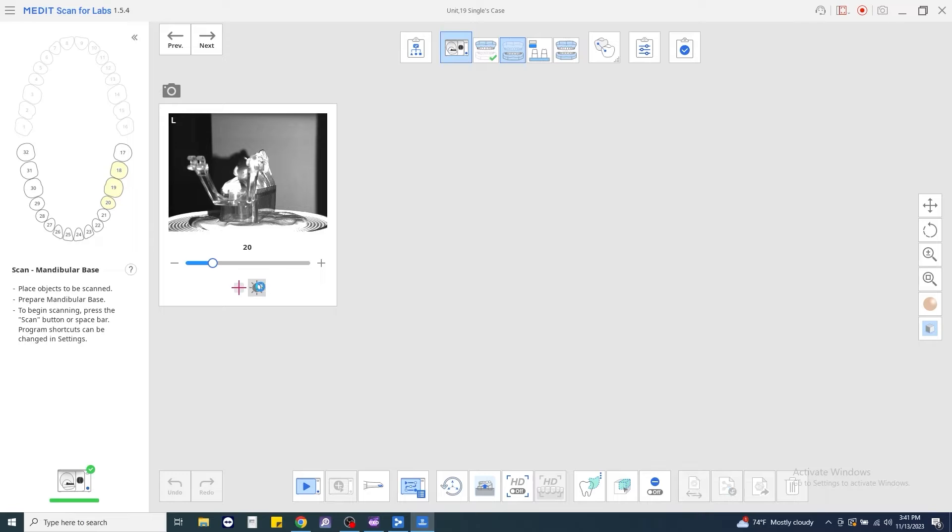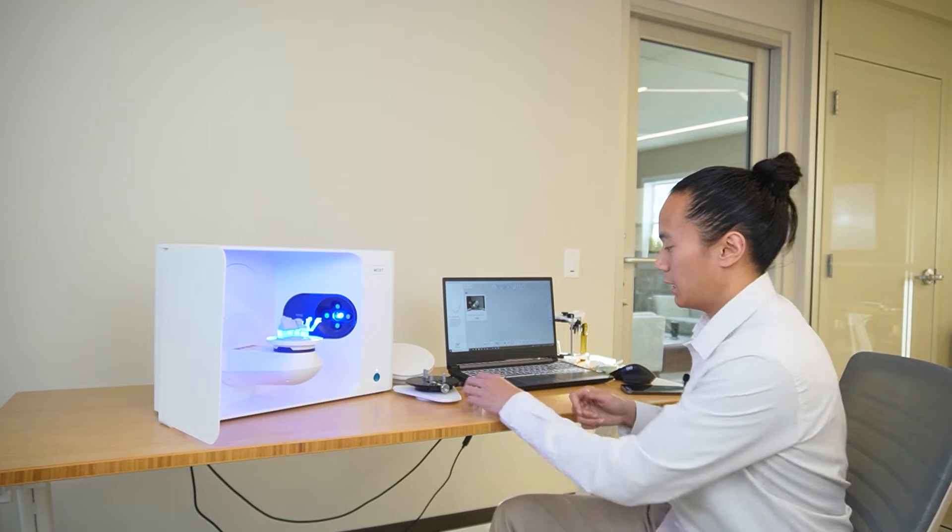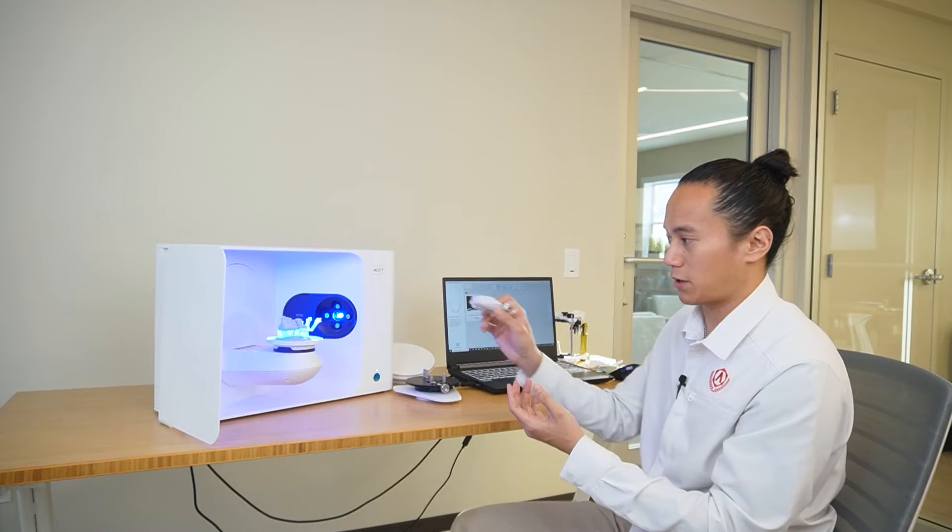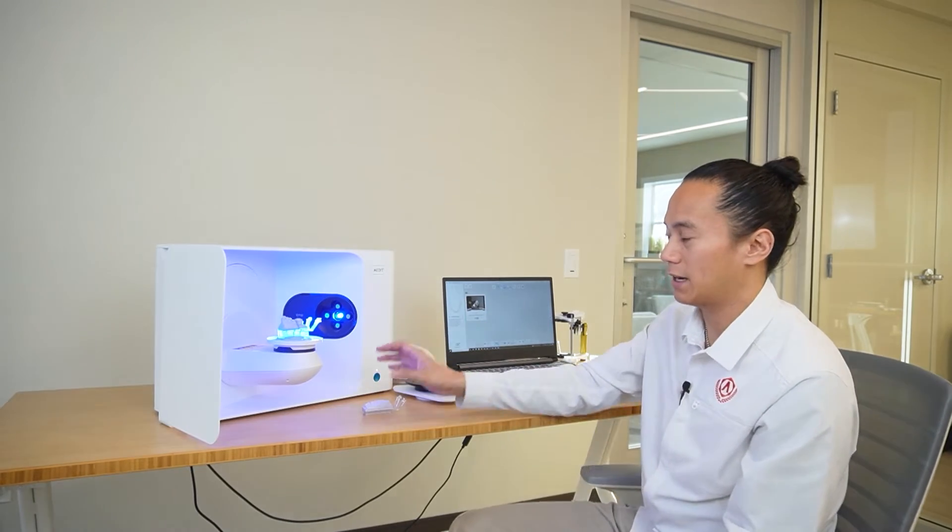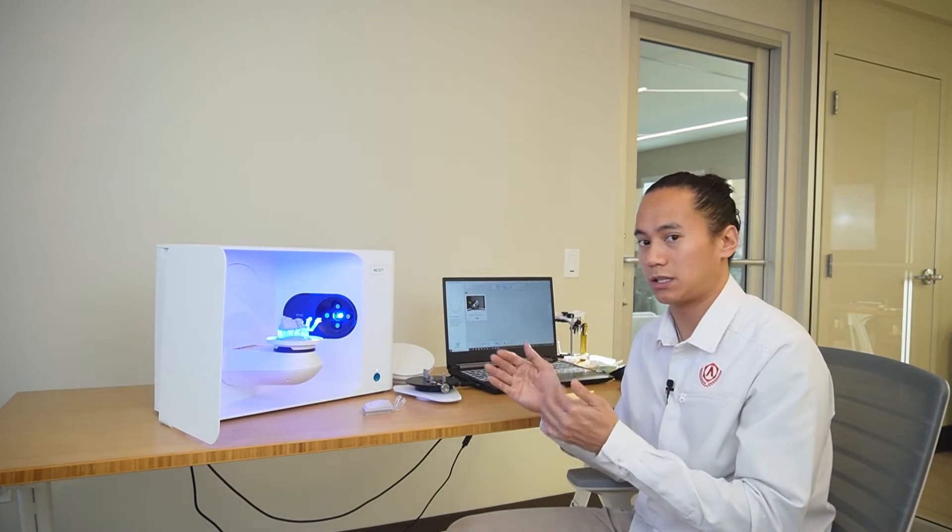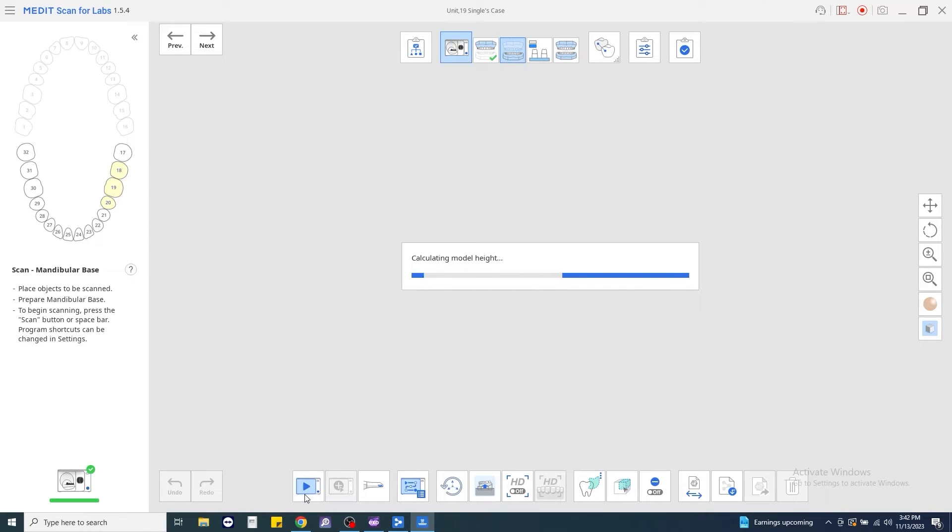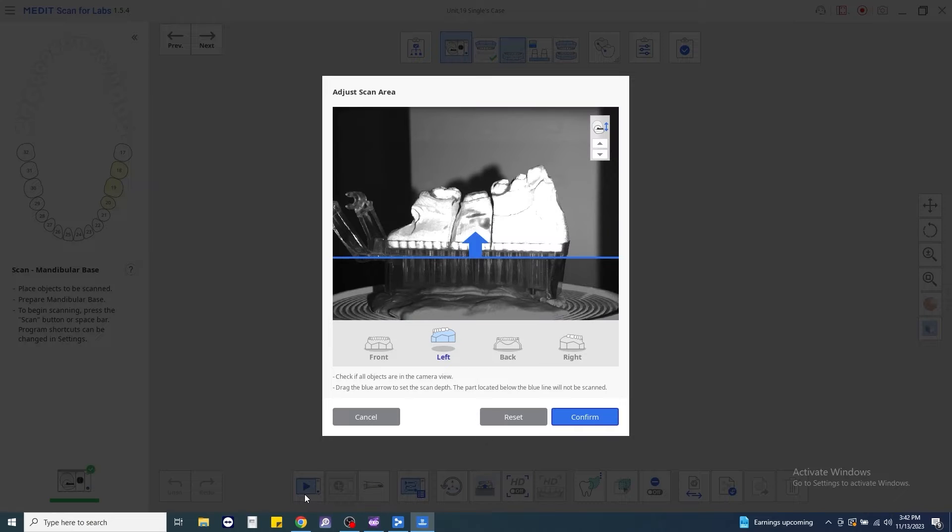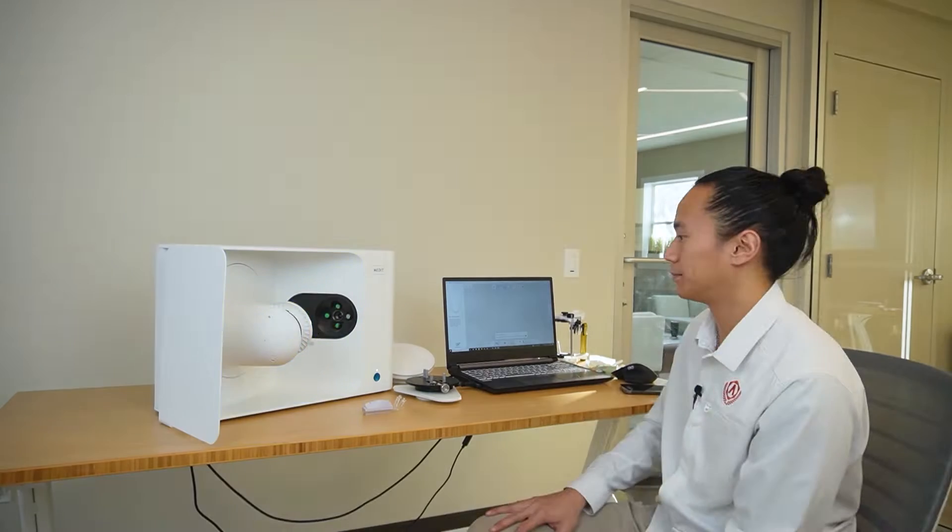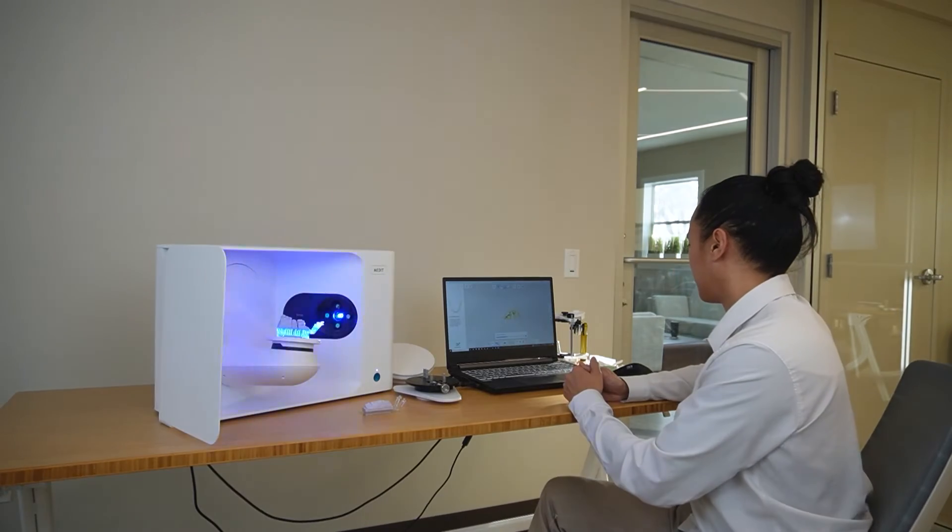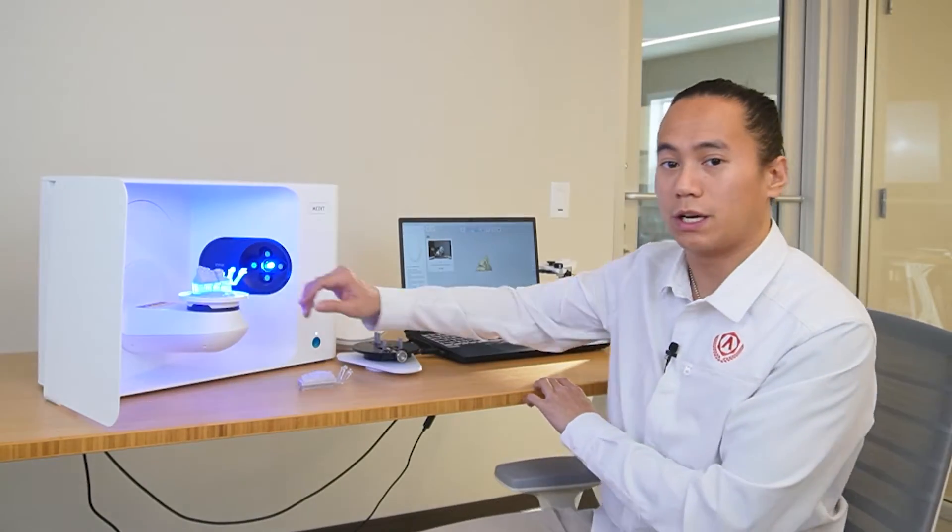We'll go ahead from there. Again, confirm your brightness. You always want to just double check your brightness every single time, especially as you can see the models are different colors. We want to make sure that the brightness has been adjusted to account for that. We can go ahead and click Scan once we've confirmed. Again, always double check the model height and confirm.